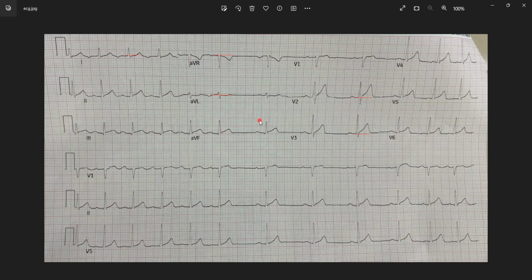As far as I know, he did go to the cardiologist because they couldn't come up with a definitive diagnosis. I think there was evidence of myocardial damage, but there was also evidence of pericardial involvement as well. So it was quite strange, and from my understanding, there was a continued rhythm disturbance as well. But I hope I'm not mixing it up with another patient.